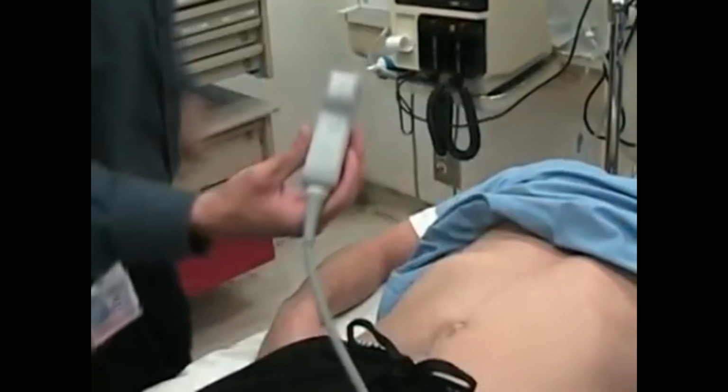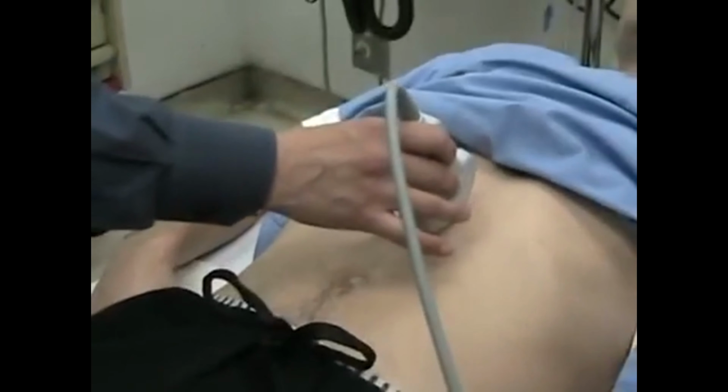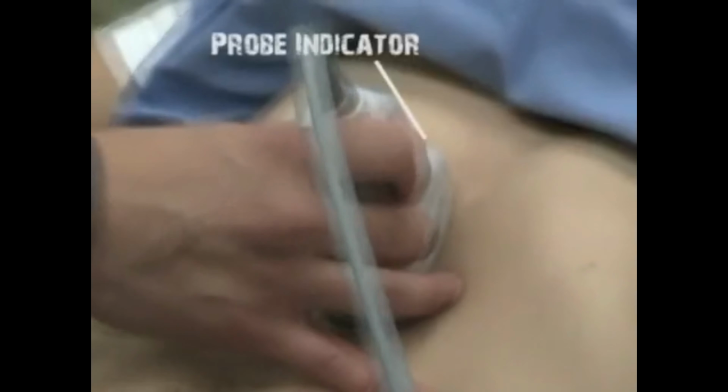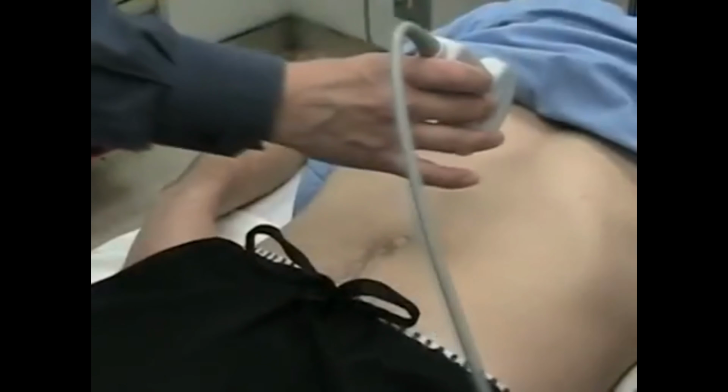And I'm going to be demonstrating the proper technique to visualize the inferior vena cava. All right, so what Danny's doing here is he's just taking a curvilinear 3 to 5 megahertz probe. He's aiming the indicator towards the head. He's placing it just under the xiphoid process, and then he's just sliding 1 to 2 centimeters to the patient's right. So that's the deal.